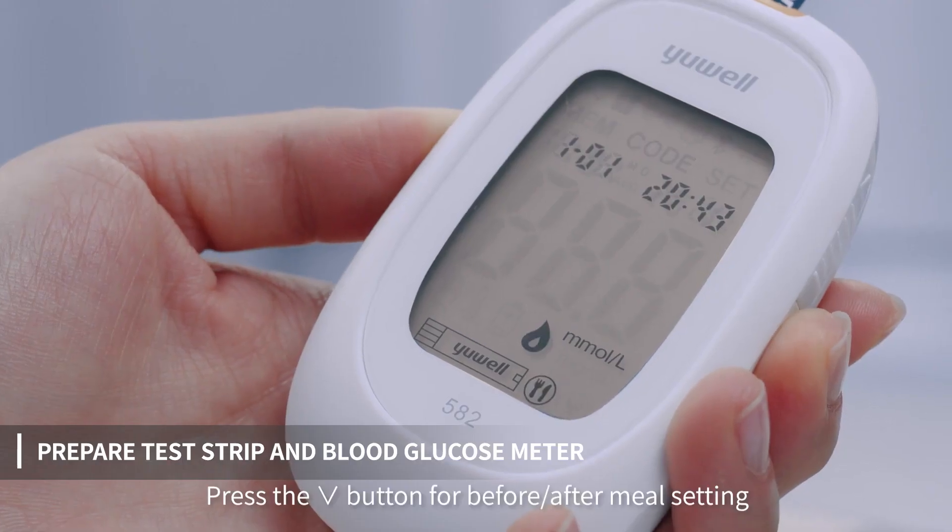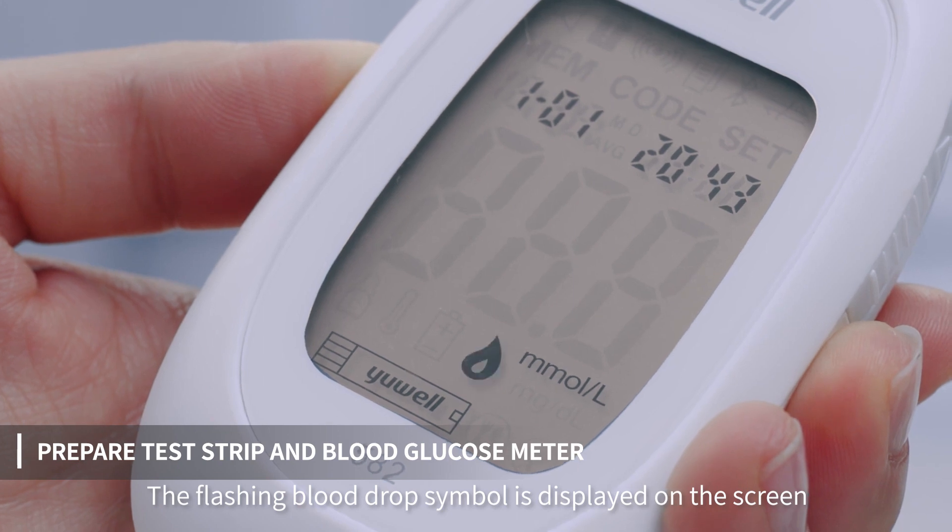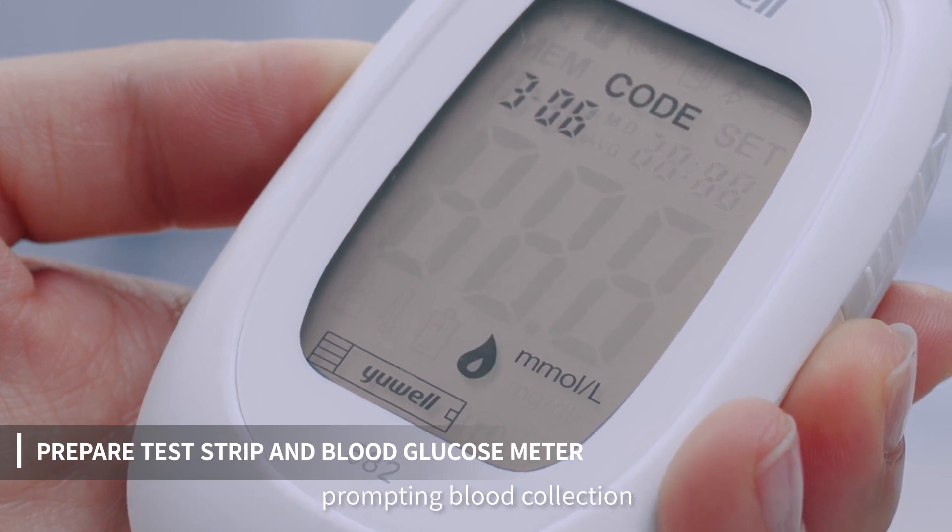Press the down arrow button for before or after meal setting. The flashing blood drop symbol is displayed on the screen, prompting blood collection.